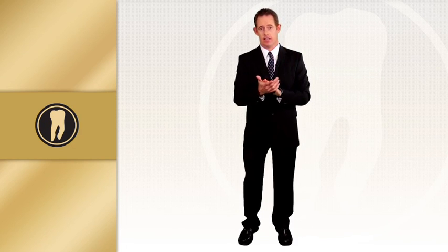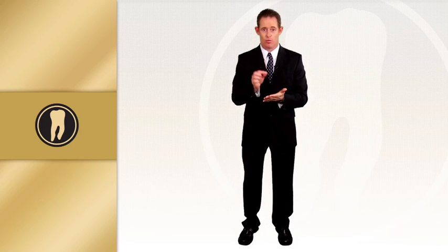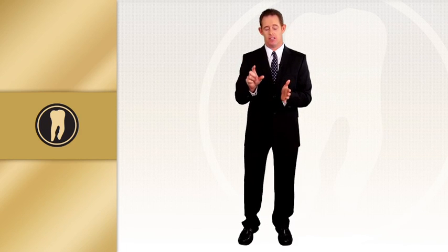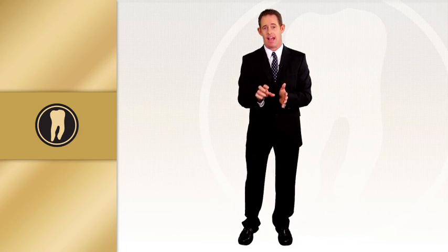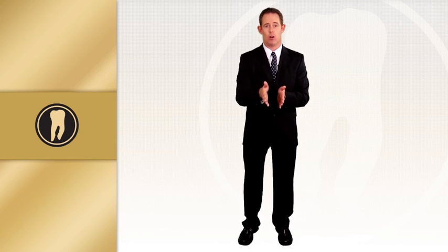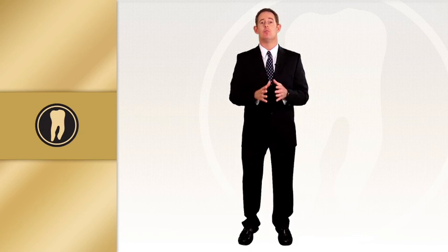And then the last thing is to remember, small bites. Take small bites when you're accessing those teeth. Be patient. Have your assistant continually wash and dry the access prep and check your angulation to make sure you don't have any type of mesial distal drift or buccolingual drift, and you're right on the money. If you can do this, you're going to be successful in your root canal treatment. Thank you.